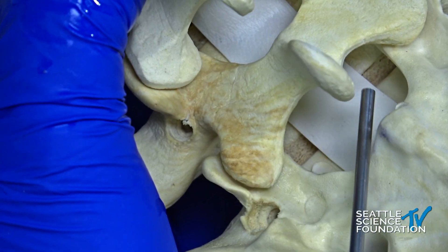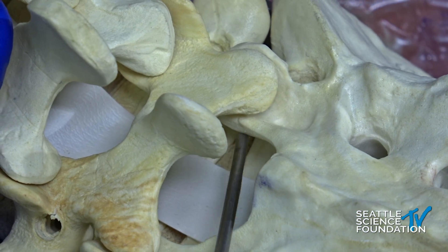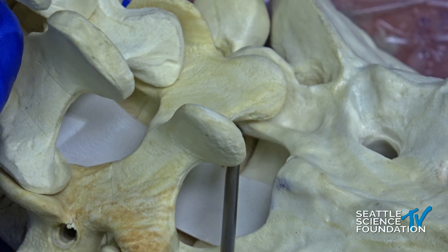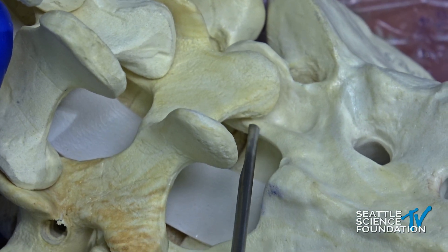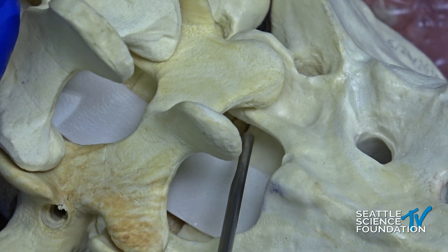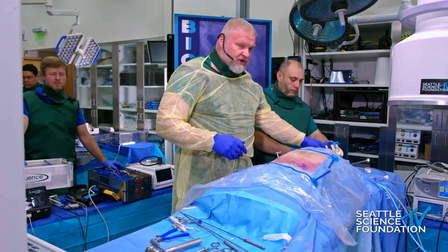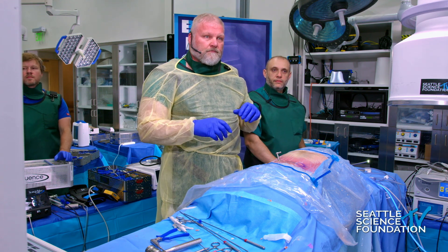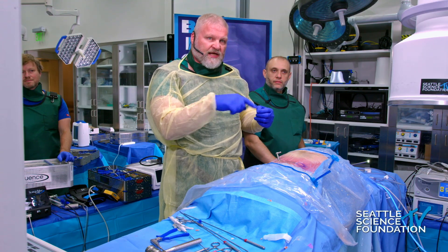For the gouge: when the ligament is attaching to the undersurface of the lamina, gouging the undersurface peels little strips of bone off. This is particularly good contralaterally — if you're trying to get the tip of the SAP contralaterally, put your gouge in right here and break these pieces off. Since this is shooting lateral to the traversing root, it's a safe cut even if you plunge a little bit. It's faster than a drill, no high-speed equipment, and it's reusable. The only issue is cut bone may bleed since you're not burnishing as you drill.